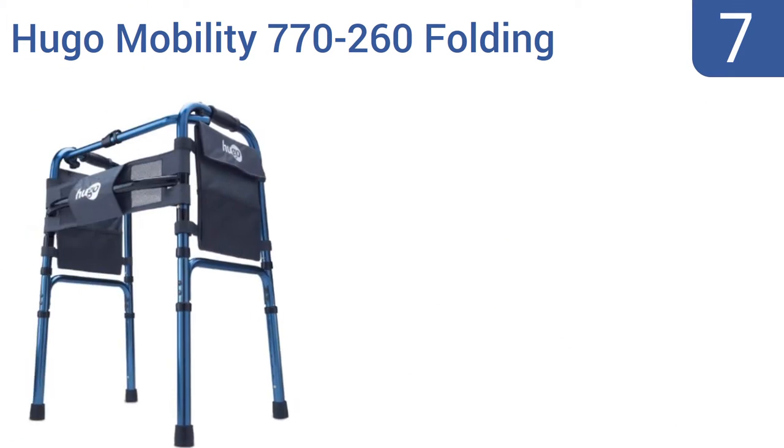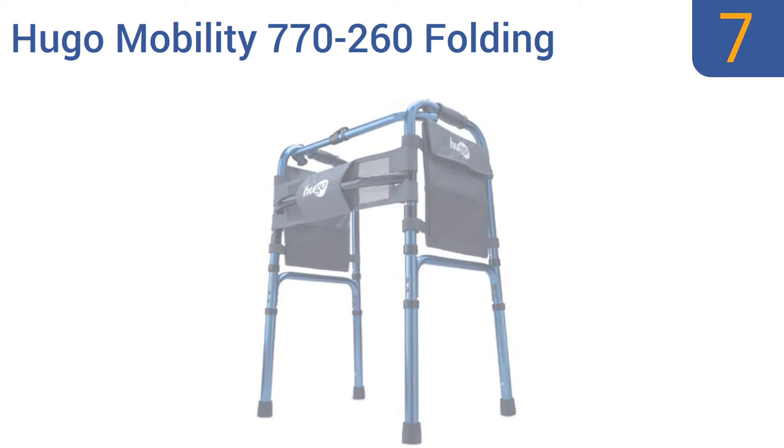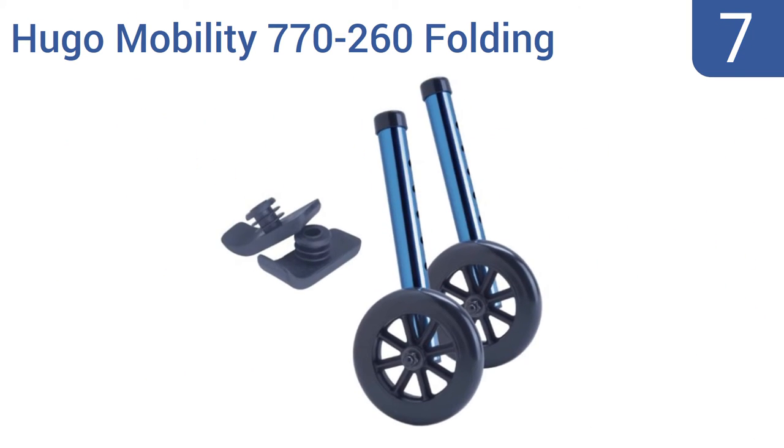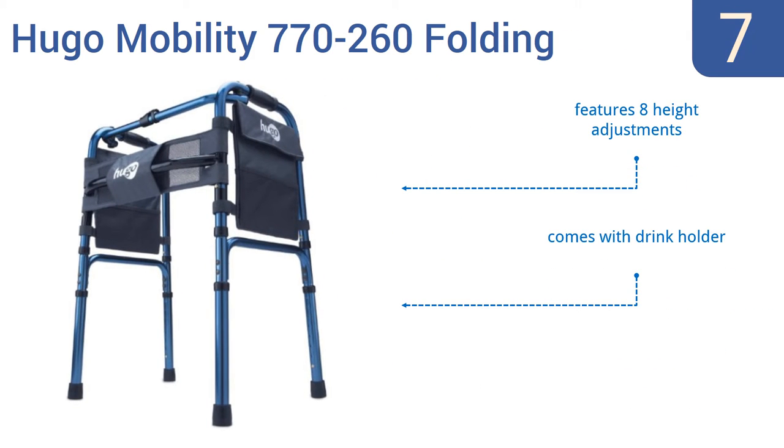Starting off our list at number 7: the Hugo Mobility 770-260 Folding Walker. Its primary purpose is to create a solid platform for slow, stable walking or easy standing. Attach its included wheels and/or glides and you can pick up the pace while still being supported by a four-legged frame. It features eight height adjustments and a drink holder. Note that some assembly is required.